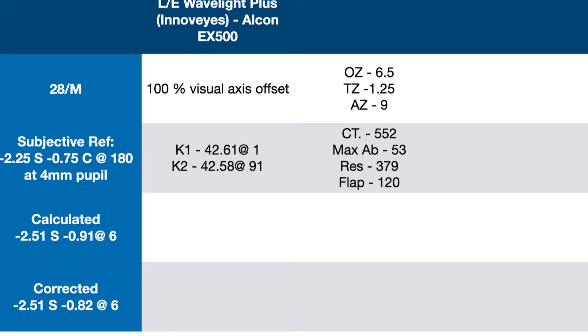We are doing a 100% visual axis offset. K1 and K2 are 42.61 and 42.58. Optical zone 6.5, transition zone 1.25, ablation zone is 9. Corneal thickness of 552, maximum ablation is 53 microns, residual is 379. The flap thickness that we are taking is 120 microns, made on the ELITA silk machine.